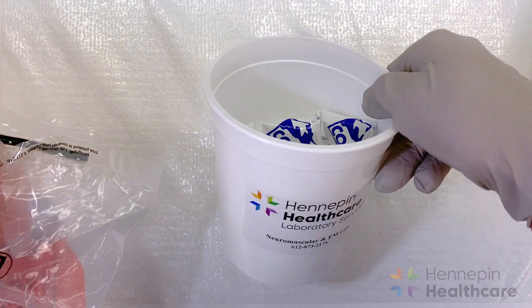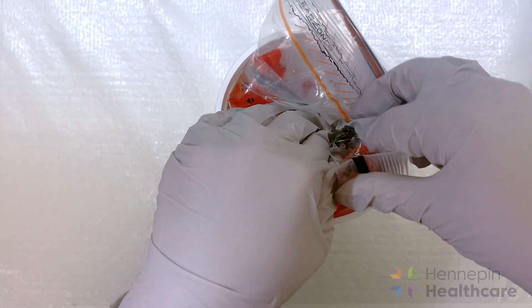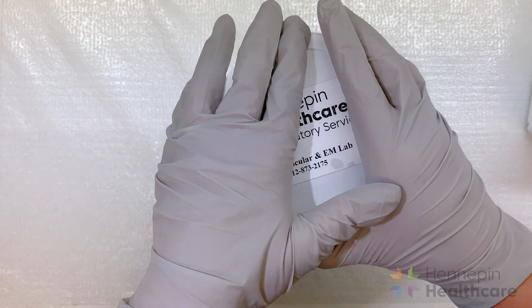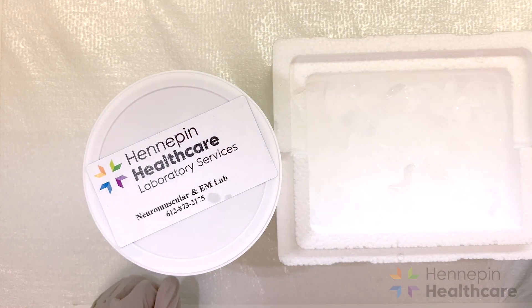Specimens can be sent in a specimen bucket or bag for local deliveries, or they can be placed in a styrofoam box for further deliveries. Keep in mind that we don't want the tissue to freeze in transit, so avoid overpacking the container with ice. If the tissue freezes before it gets to the lab, freezing artifact can develop on the tissue.